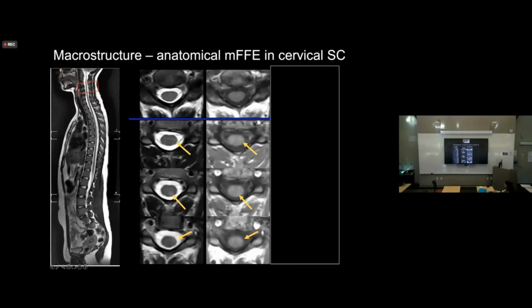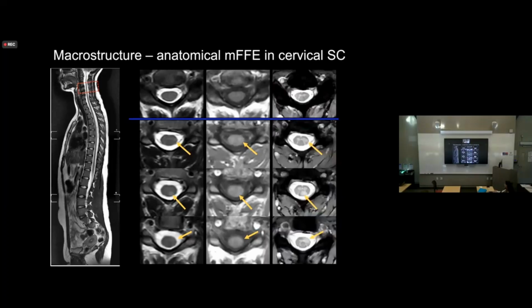But with improved imaging, with different types of imaging, different sources of contrast, things like the multi-echo gradient echo sequence where you merge echoes together, and this would be equivalent to the MERGE sequence or the MEDIC sequence on different vendors, those lesions really start to stand out quite a bit more than they do even on clinical imaging sequences. But in order to make that jump into the clinic, there has to be a lot of testing and evaluation, and that's some of the first things that need to be evaluated.